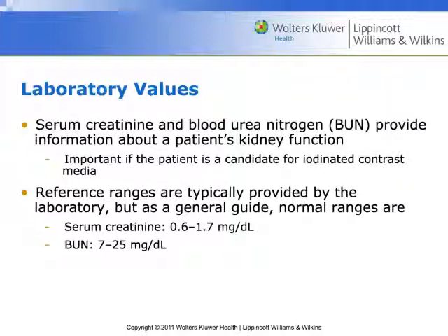We call that stuff CYA history. Right? Why is this person breathing on the CTA of their chest? Well, non-responsive, unable to listen to breathing instructions, right? This is no longer CYA, this is something you do on every single person. If you don't do this, you fail, right? You failed CT.